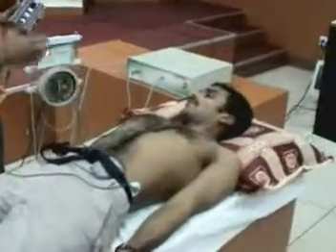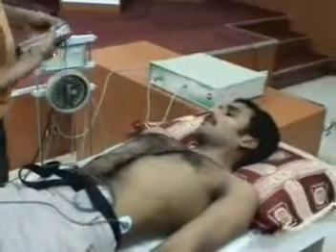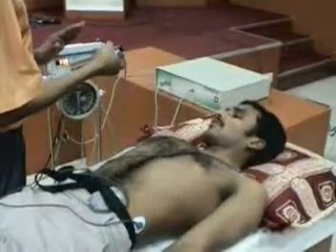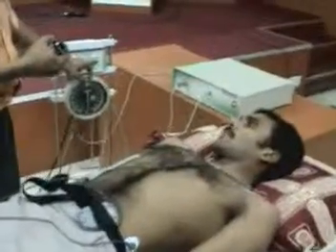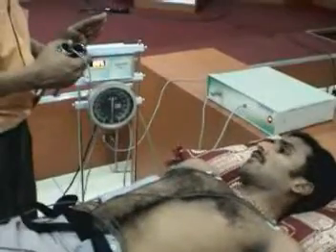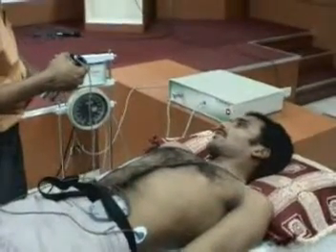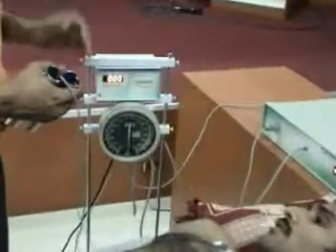So now this is the last test which you're going to do. I'm doing it for you. This is a sustained hand grip. All that you have to do is maintain a constant pressure and keep it sustained for the entire course of your test. Now how do you know the entire course of the test? Initially there will be a green light displayed. At that point it says to get ready, and at the same time be relaxed. When the red light comes, you have to maintain a sustained pressure. If you see, there will be some numbers displayed on this hand grip indicator. You have to maintain it above 300.